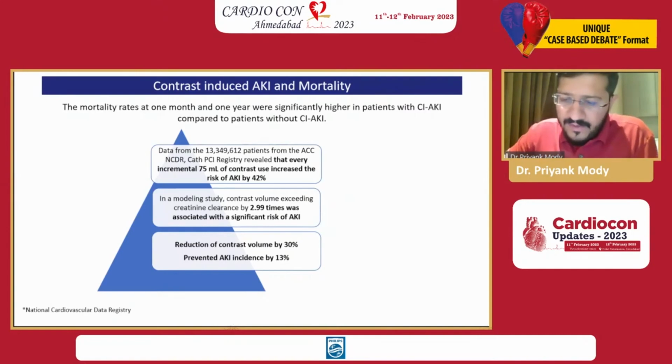And we all know that Osteal LAD lesions are the lesions in real life practice where we require maximum dye because we really want to place the exact stent. Maybe left main to LAD crossover would require far lesser dye. So reduction in contrast volume by just 30% would prevent AKI incidence by 13.